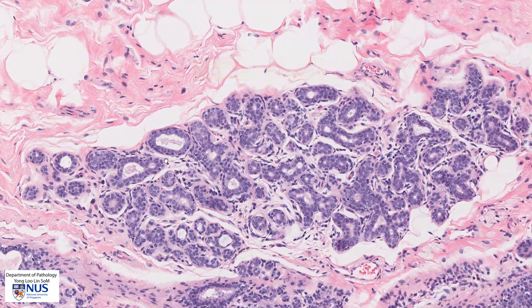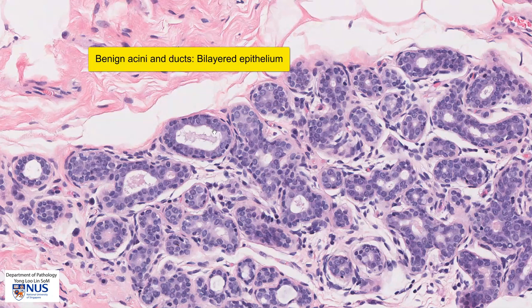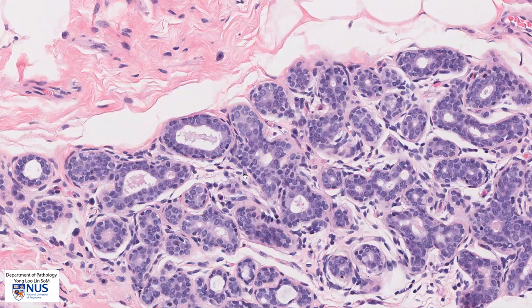A very useful point to note is that when you look at benign breast tissue, the acini as well as the ducts are lined by bilayered or double-layered epithelium, with the inner luminal layer and the outer myoepithelial layer. This is a very useful clue that you are looking at benign breast parenchyma, because in breast carcinoma the lining of the malignant glands is a single-layer lining.